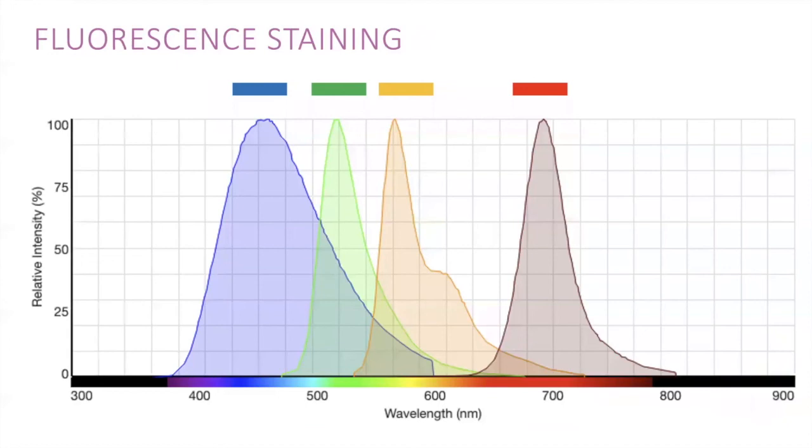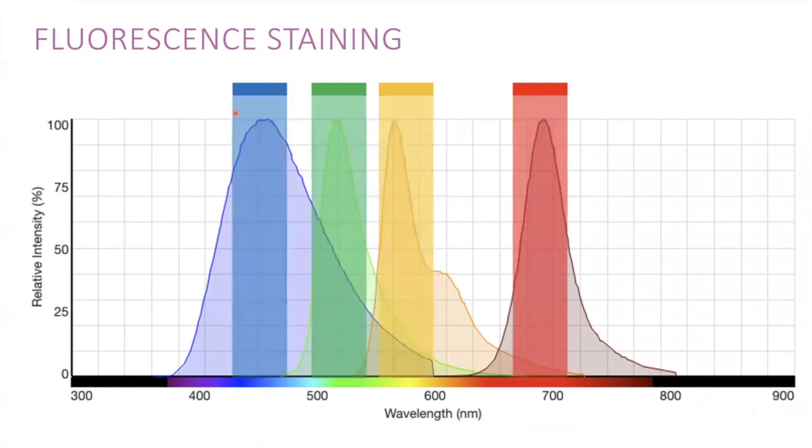So on a standard microscope, as I mentioned, you're pretty much set for 4 or 5 fluorescent stains, and this is because we use something called a bandpass filter. So for our DAPI channel, we're going to collect the wavelengths that are emitted only across these wavelengths. For our green channel here, only across these wavelengths. For our yellow wavelength across here, and then for our red wavelengths, only across these bandpass. And you can see there's fairly minimal crosstalk or bleed through between those fluorophores.